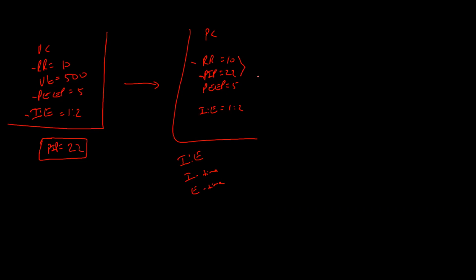So, and I can't tell you which one you're going to do because it depends where you are on that scale. If you're already at a high respiratory rate, well, you might want to consider going up on the tidal volume, meaning the peak inspiratory pressure instead. Right. Usually or vice versa. Okay. But yes, you're right.